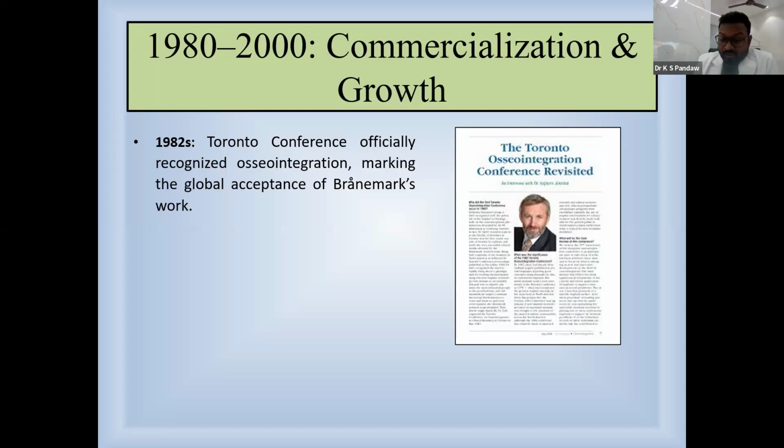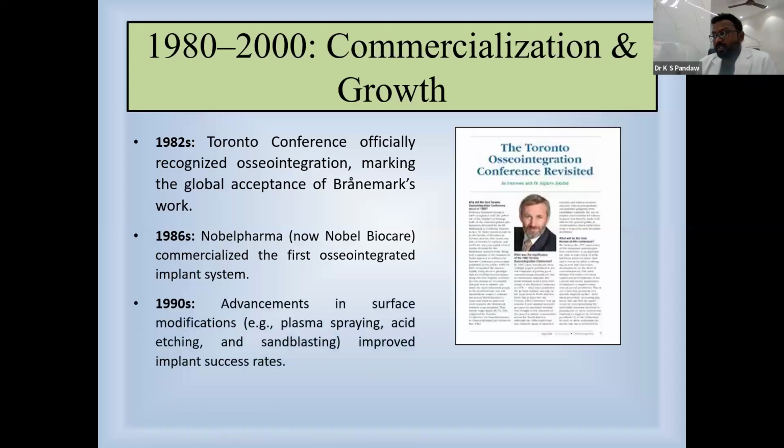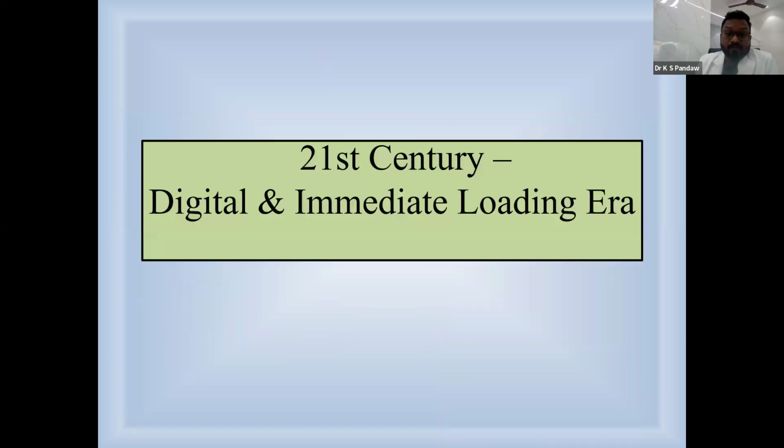Then the work on titanium began. In 1986, Nobel Pharma, now known as Nobel Biocare, commercialized the first osseointegrated implant system. Then we worked on how to modify the surface and how to modify the design for getting better osseointegration.